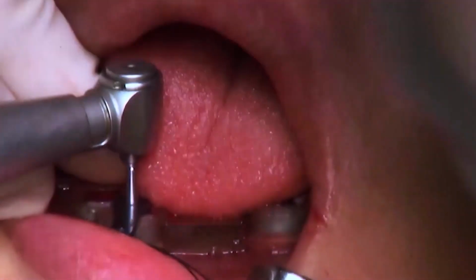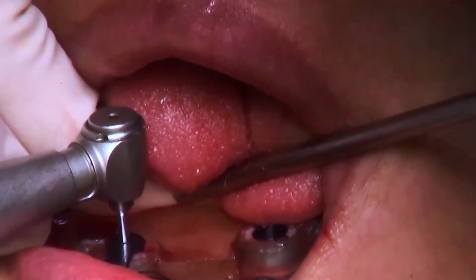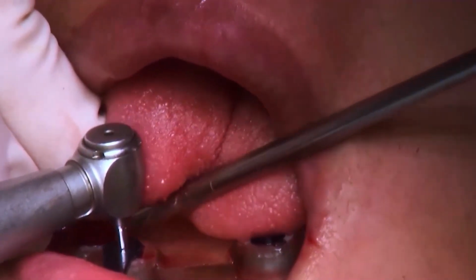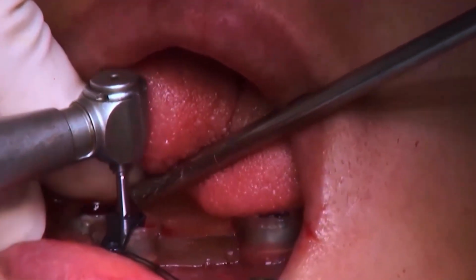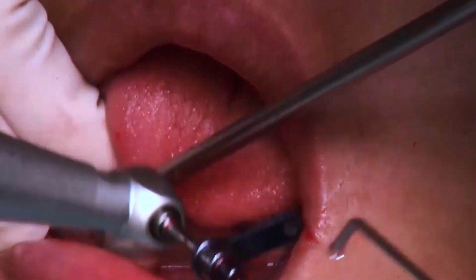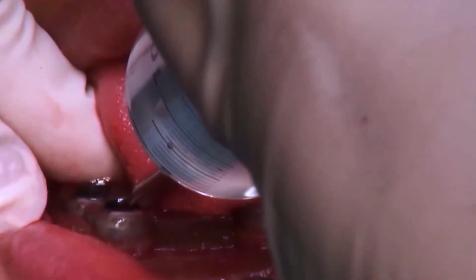This is the first drill, which is 2.0 millimeter in diameter and 5 millimeter in length. The drill uses a guide tube.